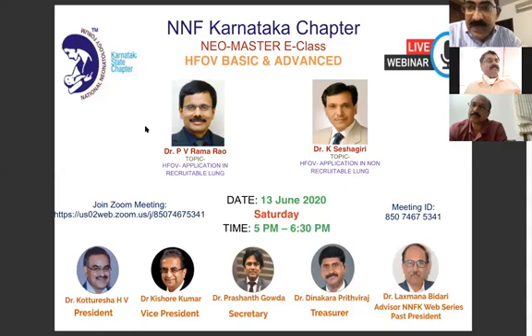Yeah, very, very good question. This is from once again Delhi, Dr. Lalan. It's a very valid question. The Fabian has it. As I've said, we need to be more close to physiology. What is physiology? Inspiration to expiration is 1:2. That is the usual thing, right?